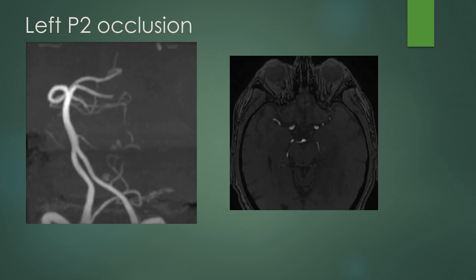On the vascular imaging source images, you can see the right PCA, left PCA, and an abrupt cutoff of that distal left P2 segment. Better seen on the MIP images, you have abrupt cutoff of that P2 segment, which is the occlusion.